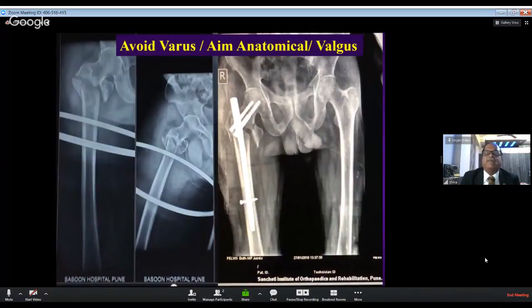To compensate for the medial void, I have used a valgus reduction. You can see that my head and neck are in severe valgus compared with the opposite side. Also, to compensate for the lateral void, I have used the head of the neck screw, and I have fixed it against the nail. You can see that the head of the screw is abutting against the nail.